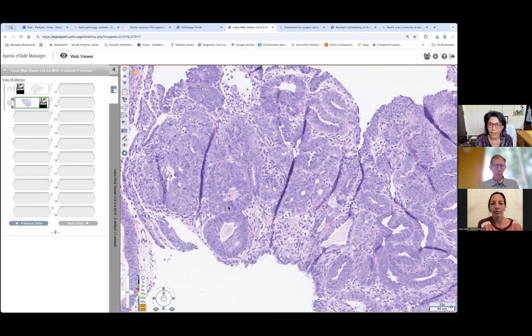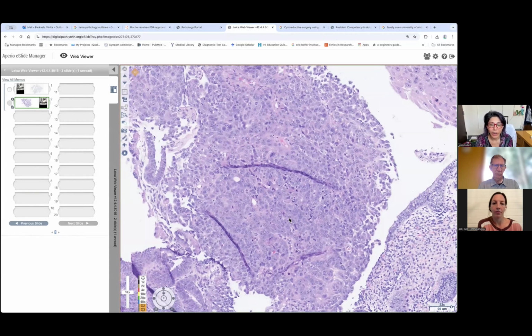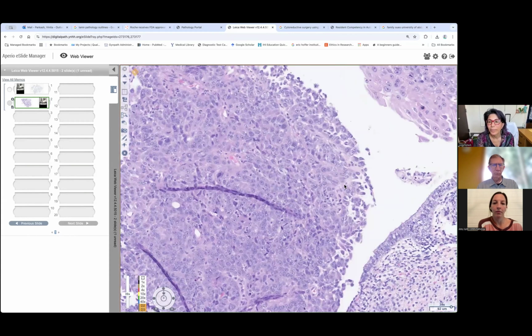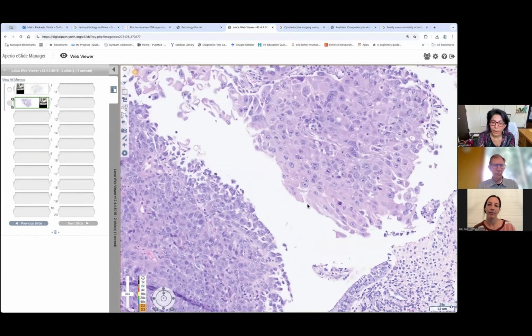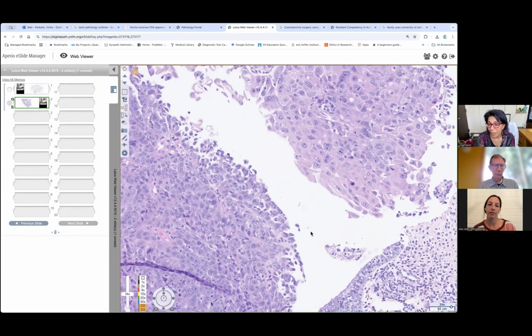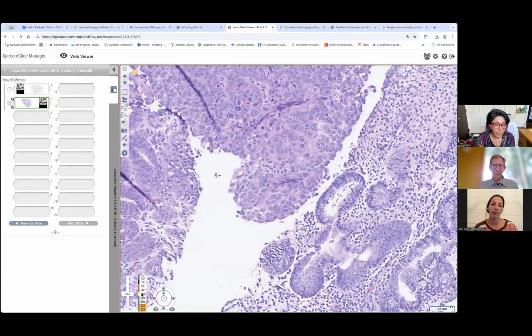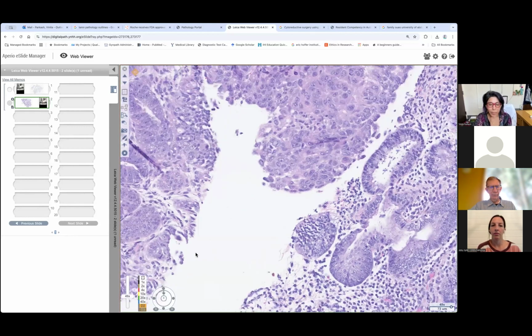And then there is overt carcinoma, as we're seeing here, which is just solid sheets of tumor with prominent nuclei, nucleoli, quite a bit of mitotic activity. Some of them are showing a little bit of metaplasia here, so you're seeing pink, more ample cytoplasm. Does anybody want to comment? Serous carcinoma? Could this be serous carcinoma? Yeah, that was our question also.